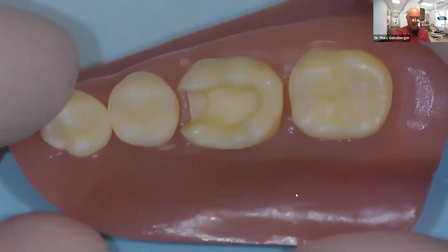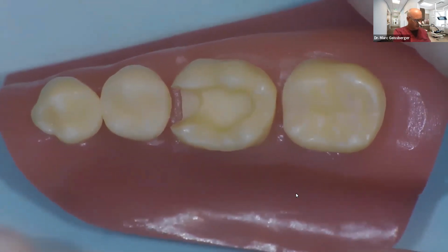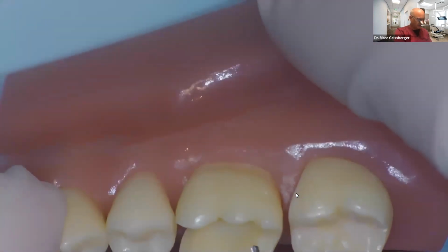So the first thing I'm going to do is flip this back around and get myself centered. And I'm going to come in here and use my handpiece with a 330 bur to place a little bevel along my cavosurface margin.